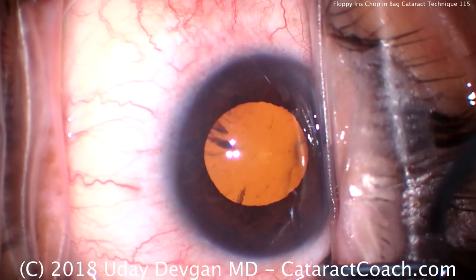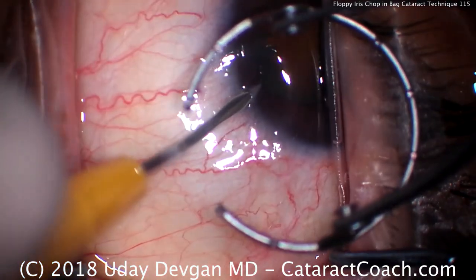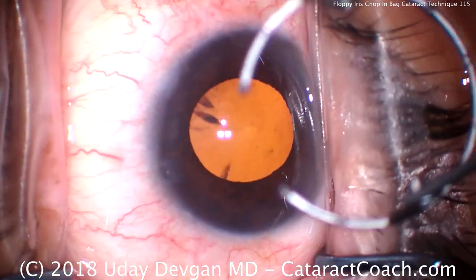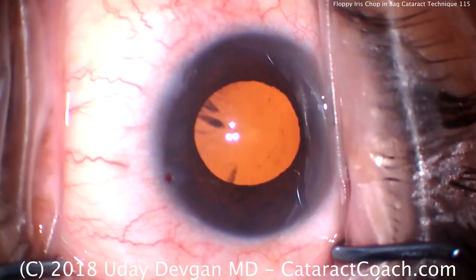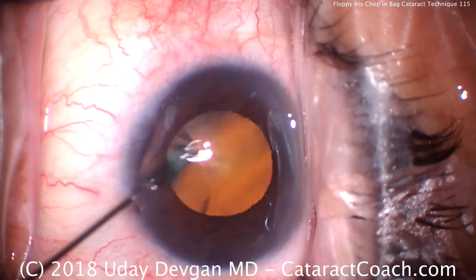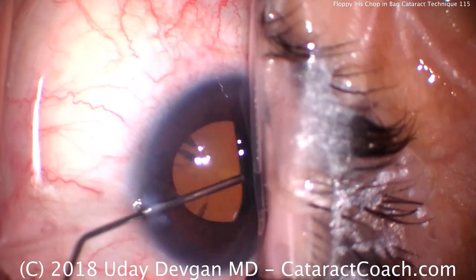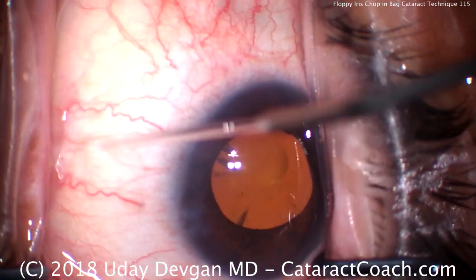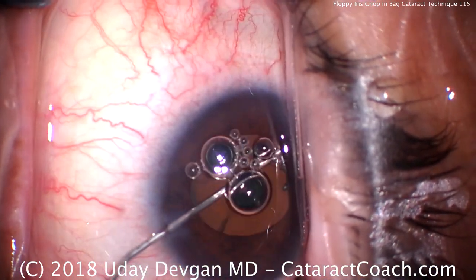Cataract coaching. We have an uncooperative patient here who doesn't want to look at the light. We can't even use the fixation ring to fixate the eye. We'll make our paracentesis here and put some anesthetic inside the eye — preservative-free 1% lidocaine diluted with balanced salt solution. This patient also has Flomax use and he's going to have a lot of floppy iris syndrome. Let me show you how it matters in these cases.